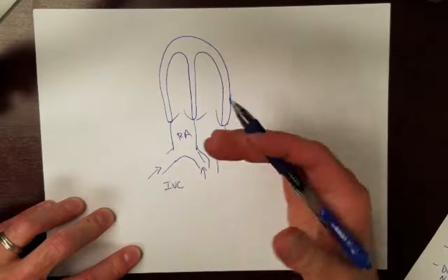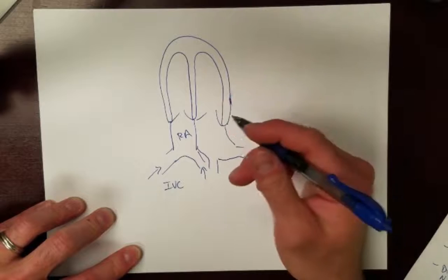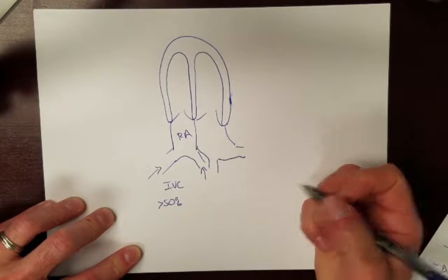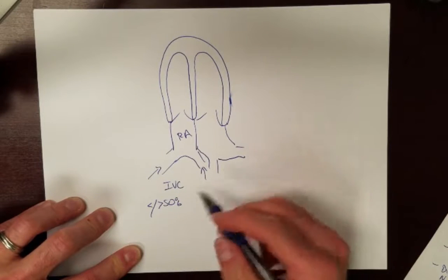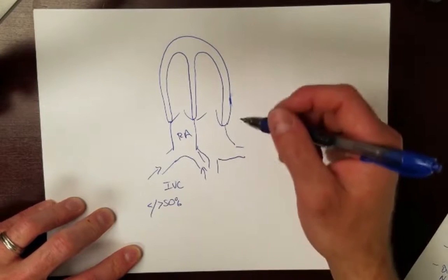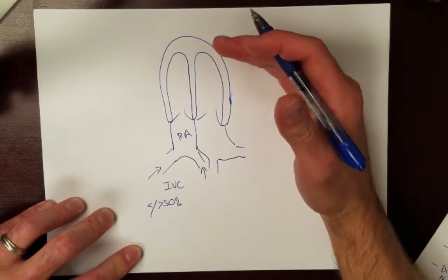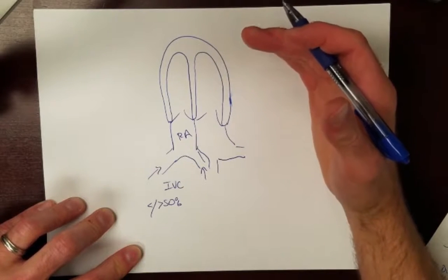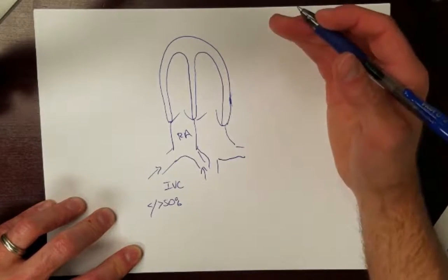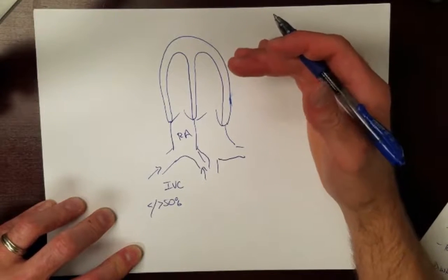And you can get really advanced with these ridiculous tables trying to get the actual number for the patient's CVP or their right atrial pressure, which I think is a little ridiculous. I just like to think of it, all right, is it greater than 50% variation or not? So is it less than or greater than 50% variation? That's how I sort of assess preload to the right side of the heart. Now, we sort of stop there a lot, but that's not really fair because we're really only assessing preload to the right side of the heart. And truly, for most of these measures, when we're talking about cardiac output, when we're talking about perfusing organs, we're talking about getting blood volume to our brain, to our kidneys, to our gut. We really should be more interested in the preload to the left side of the heart.